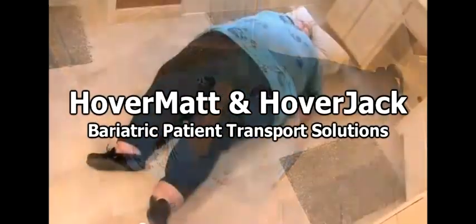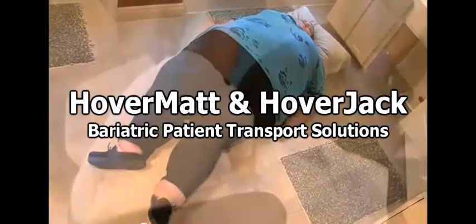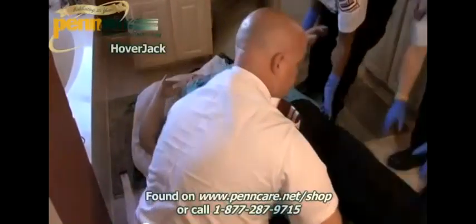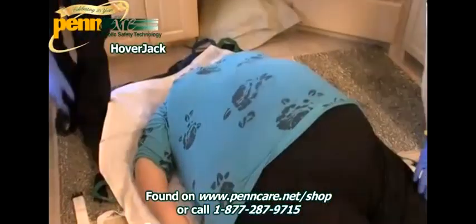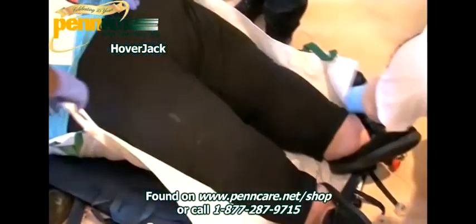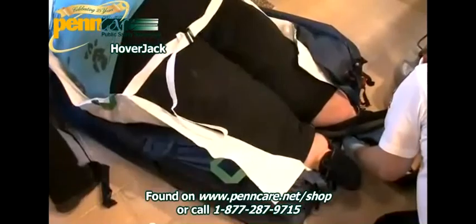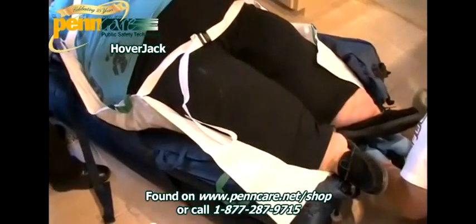How could you safely lift this patient from the ground to bed or stretcher height? PennCare's solution: the Hoverjack. Recognized as the industry standard for safe patient lifting, the Hoverjack Air Patient Lift allows caregivers to safely lift patients who have fallen without gathering a lift team.